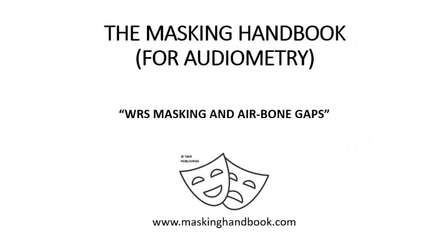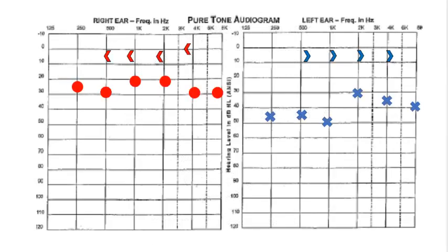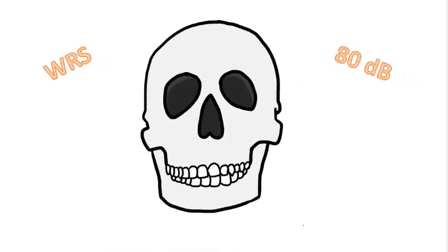In this video, we'll be looking at why air bone gaps affect masking for WRS testing. Here we have a bilateral conductive hearing loss, and we're going to complete WRS testing. This is our test subject, and the plan is to do the testing at 80 dB. We'll start with the right ear.